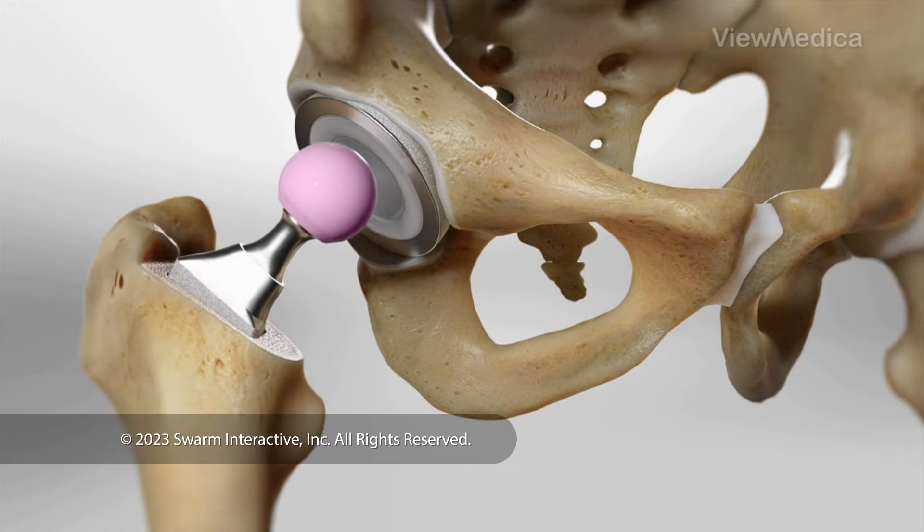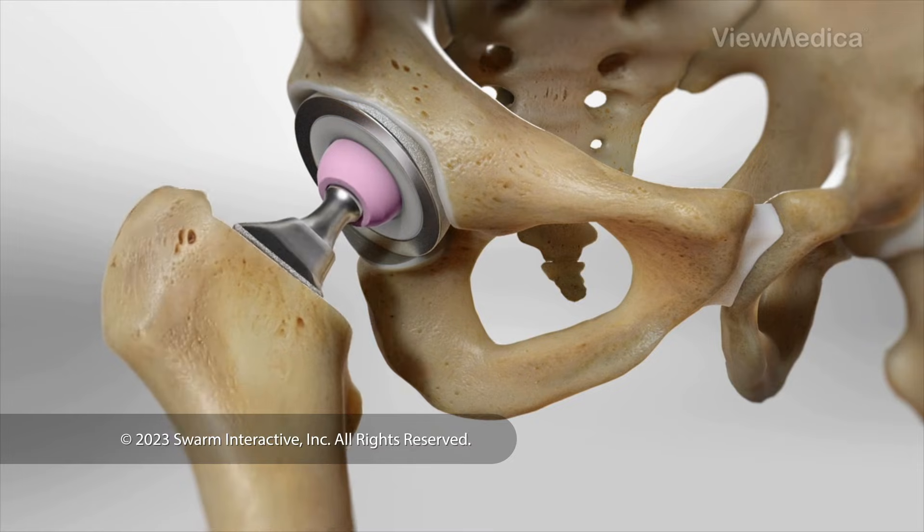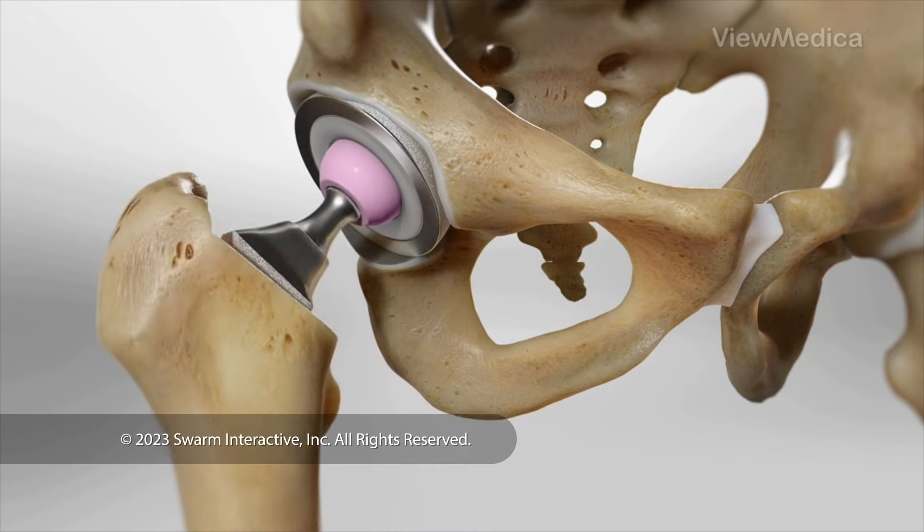Finally, we join the ball and the socket and test your joint to make sure it's working the way it should.